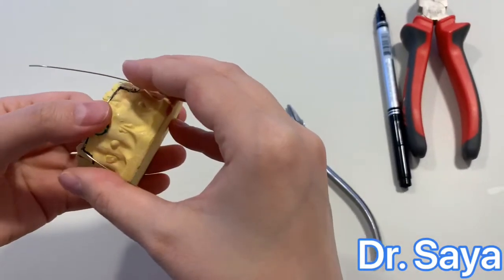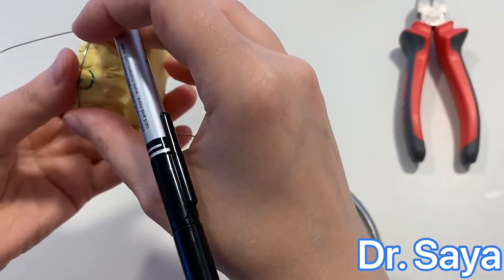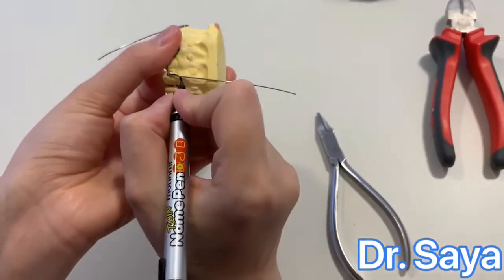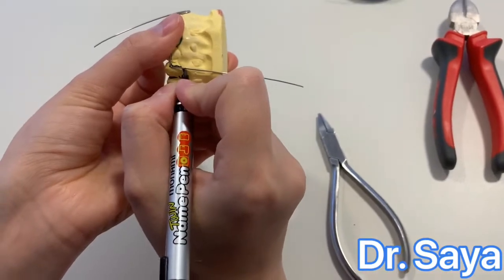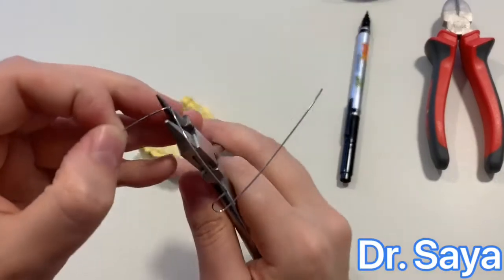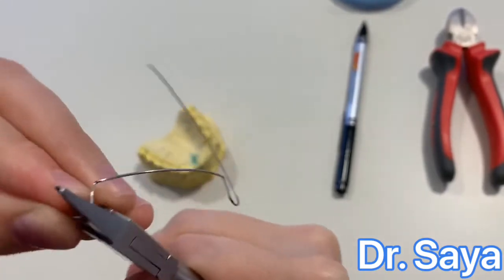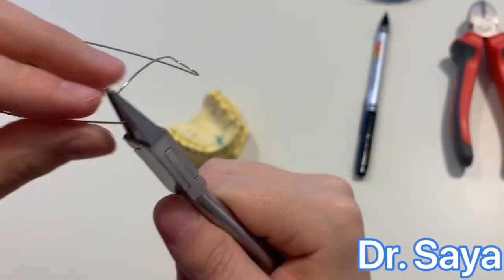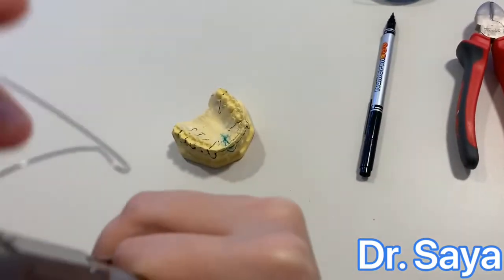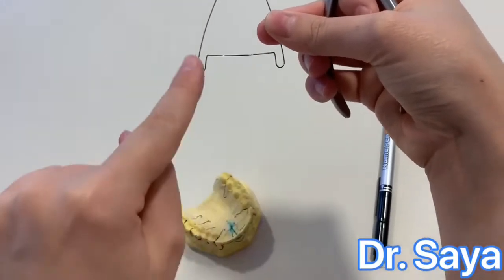We are going to do the same thing for the other side. Make sure that the incisal segment is at the incisal third of the anterior teeth, and place the two vertical loops two millimeters below the gingival margin. Mark with the wrong side of the Adam's plier and slowly rotate the plier with the loop you are making to form a U-shape. Now we have the incisal segment and two vertical loops.